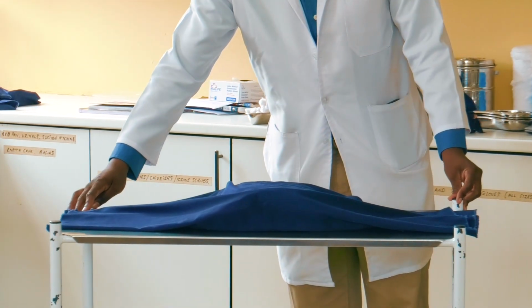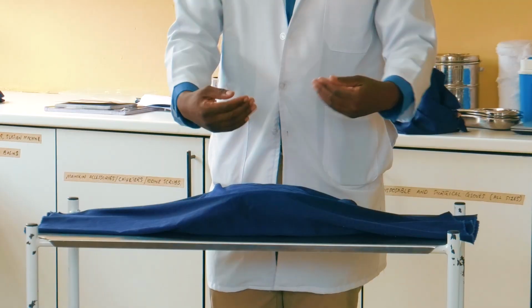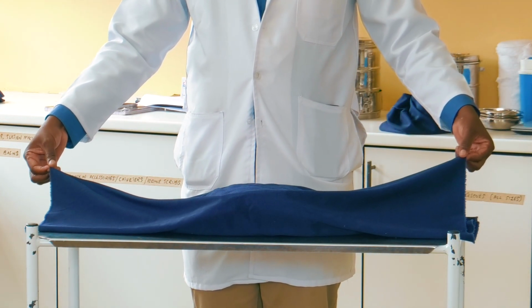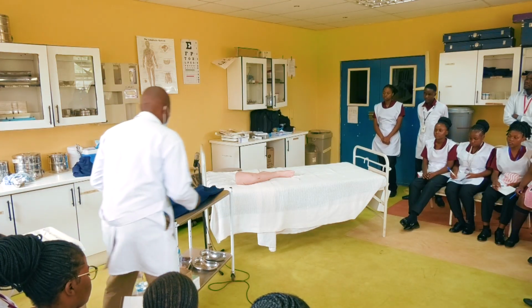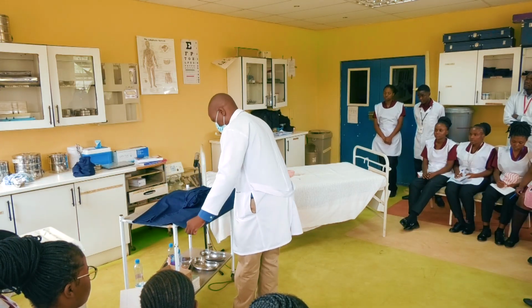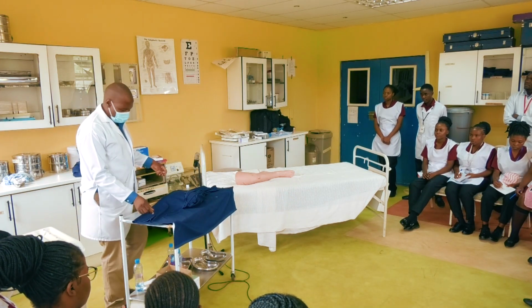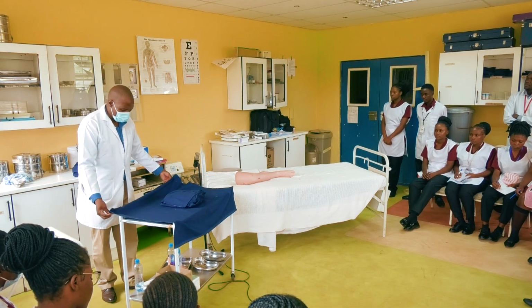Cross infection, the chain of infection: do not cross over the sterile field. Your hands are not supposed to cross it. So if I see that these are the ones that I need to start with, I can't push them this side, I need to go around, right? That principle, you know it, right? Okay? So open it like that, then you have to go around. Don't get tired. We don't want to transfer any infection to the patient.